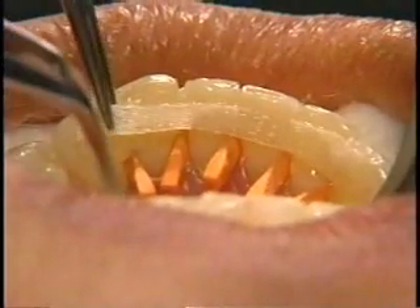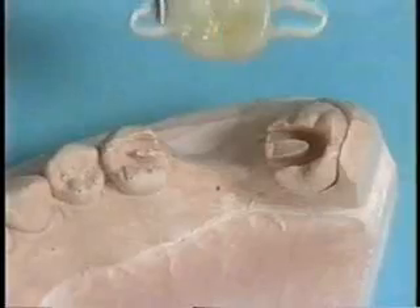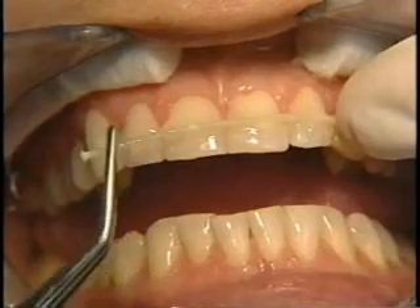Hello and thank you for joining me. Welcome to the wonderful world of fiber reinforcement dentistry using the glass band fiber reinforcement system. I developed the glass band system in response to the profession's need to reinforce composite resin structures in dentistry. Traditionally our composite resins lack the tensile and flexural strengths required for certain clinical procedures such as splints and orthodontic retainers. The purpose of our videotape today is to better acquaint you with the uniqueness of the glass band flexible ceramic system and how it's going to make everyday clinical practice easier for you.